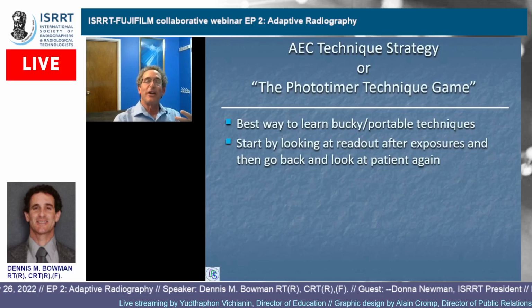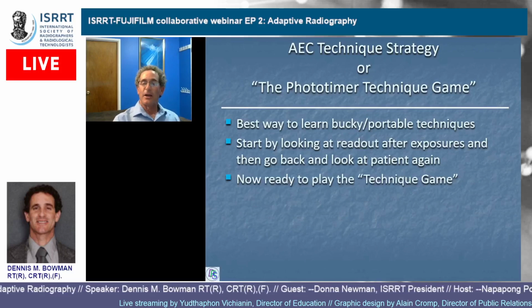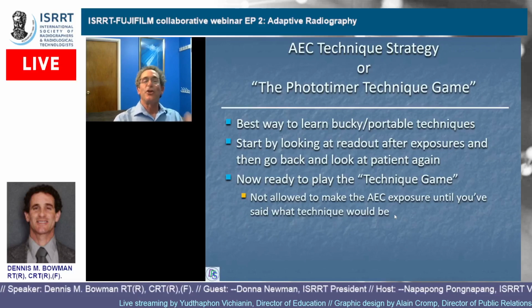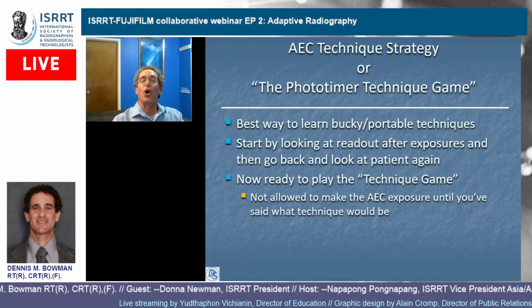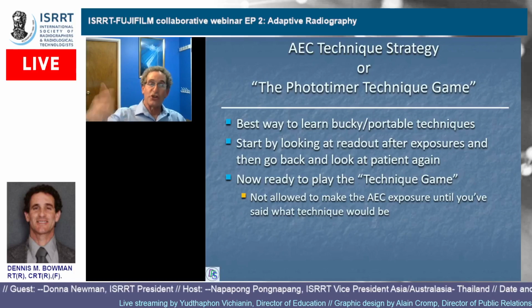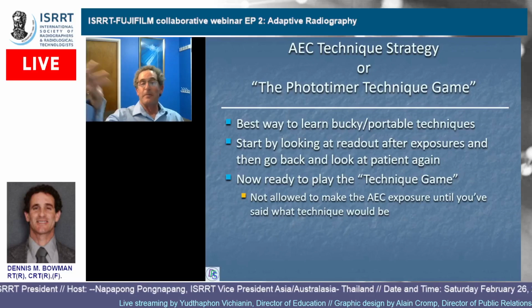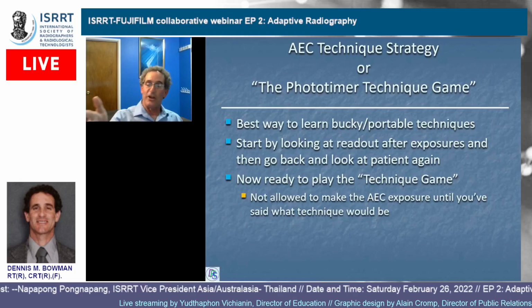Now, after you've done it enough, you just go, I think I'm kind of ready to start techniquing. Okay. Now you're ready to play this technique game. And the game is, you're not allowed to make an exposure until you've made the call of what the mAs is. Now, you're not setting up the mAs. You're not setting up a manual technique. You're still using the AEC, but you're pretending that you're not. So, you're still going to make the call, hey, it's going to be 85 at 16. Boom, make the exposure and look at it. And it was 85 at 18.